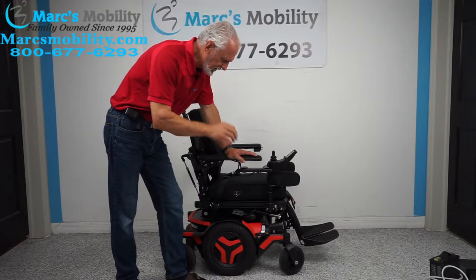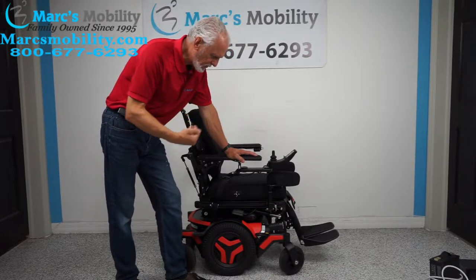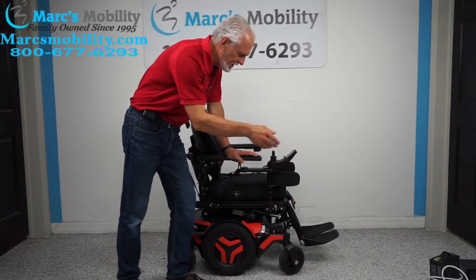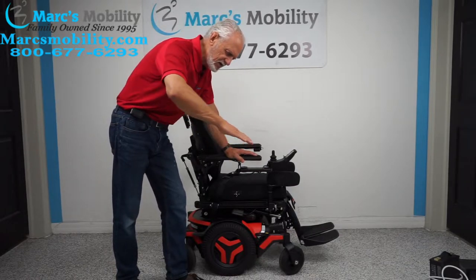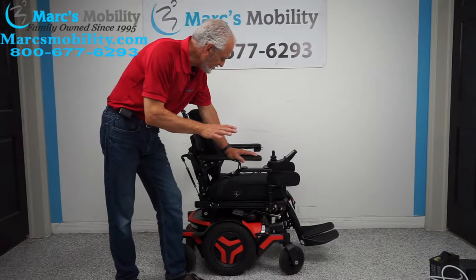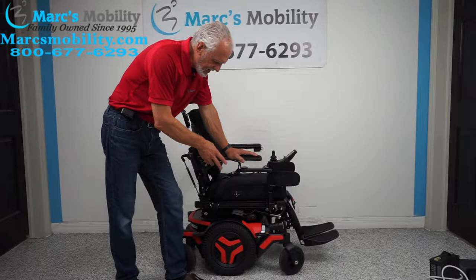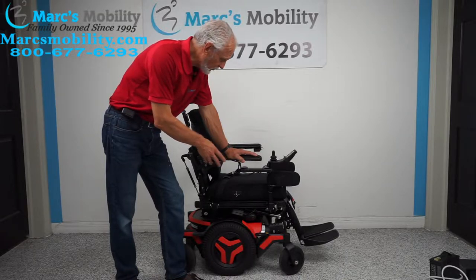It has five electrical functions: the 12-inch seat lift, the electric tilt, the electric recline, the electric feet, and this one also has the anterior tilt where the seat tilts forward to help you get out of the chair. Five electrical functions and all kinds of other stuff we'll cover. This is the latest in technology from Permobil, and the color is orange.